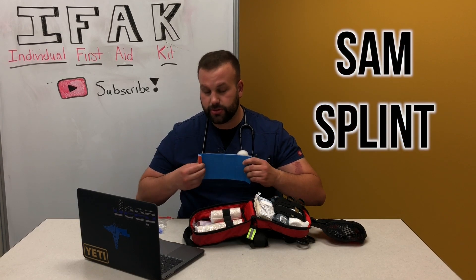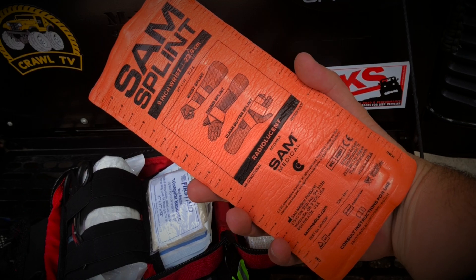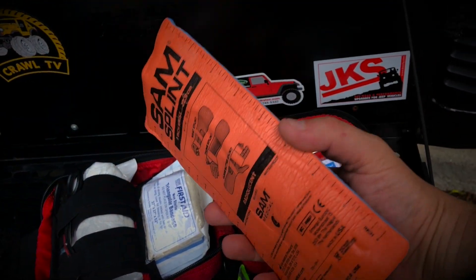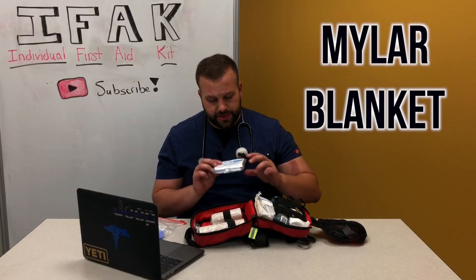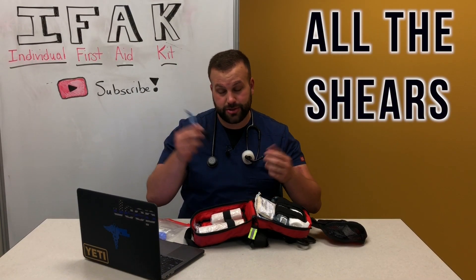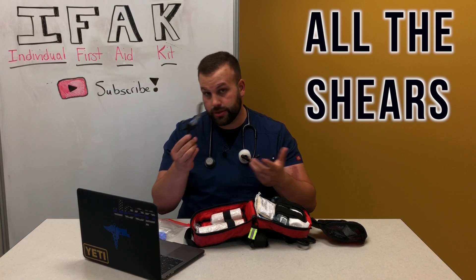Here is an eight-inch SAM splint, which is great for bone injuries when you need to make a splint — I've got a couple of other different sizes as well. Next up is a mylar blanket. And another pair of trauma shears — these are really small, but hey, if you lose your first pair it doesn't hurt to have a second, third, or fourth.